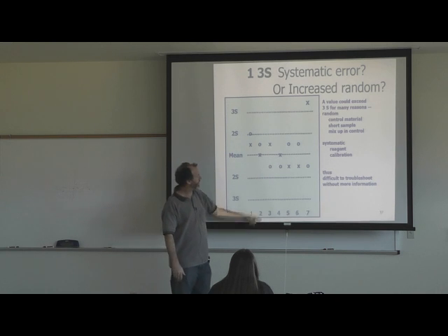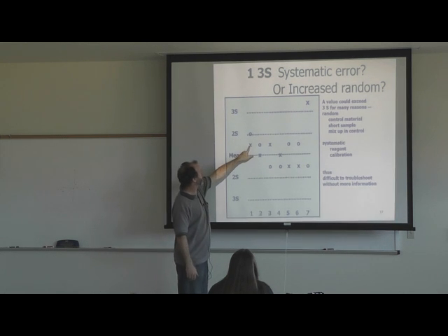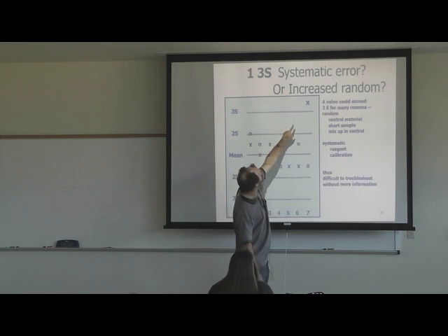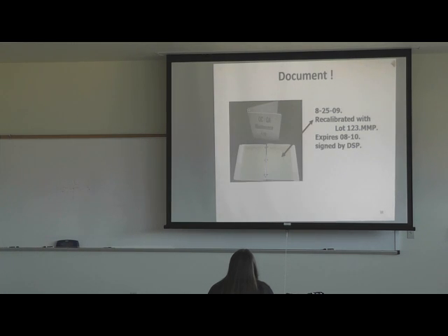These are your days or your runs. With this one, it's less than 2, or right at 2 basically, and this is less than 2, no problem, no problem, no problem. And then up there, one is above 3 standard deviations, so you're going to stop and troubleshoot.